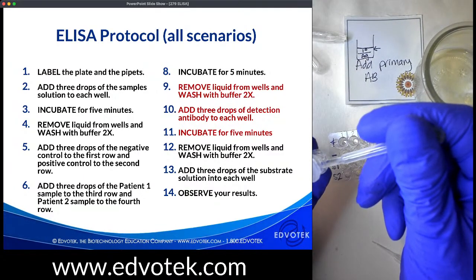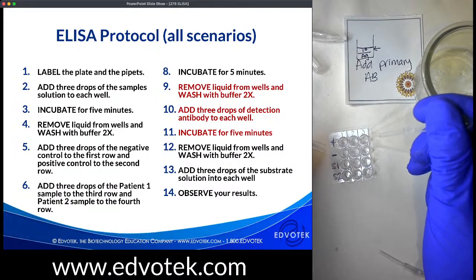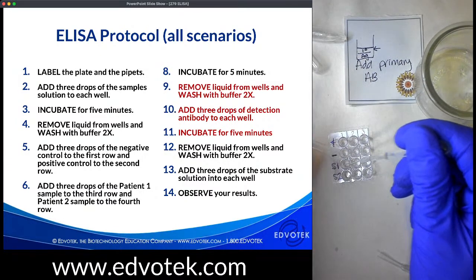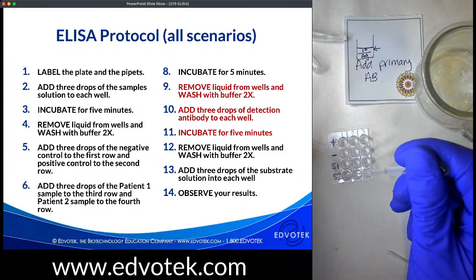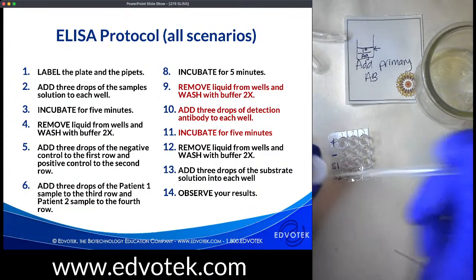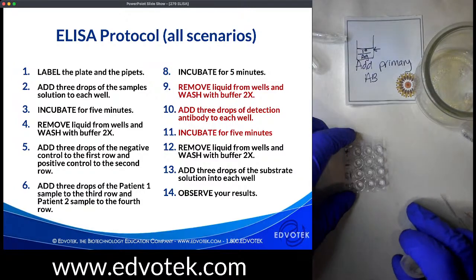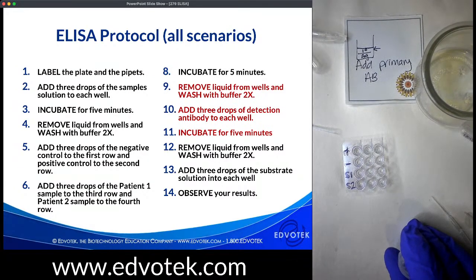What I would say is if you're looking for a specific ELISA to use as a simulation, I would take a look to see what tests are specifically ordered by a county coroner in suspicious situations. I do know that there are ELISAs for a lot of the most common drugs, and these ELISAs are used to analyze biological samples. You will see some done using GC mass spec. I think that happens when you need very quantitative amounts, and that might be what is done for an autopsy, where you want to figure out if something is a byproduct or if it's actually present in intoxicating levels or in murderous levels.